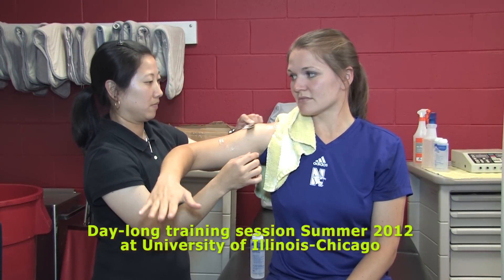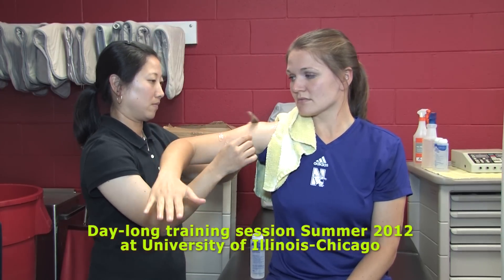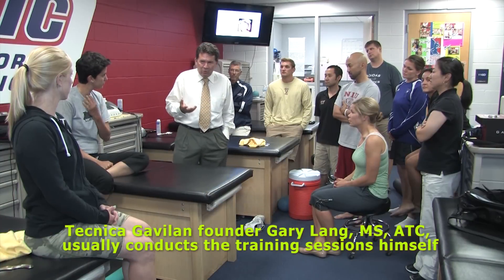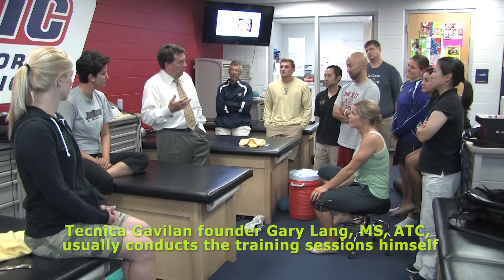She is performing a sweeping technique as Laura is going through external rotation. They are working on the rotator cuff, exposing any sort of adhesions in the fascia. Finding the thing that reproduces the pain, the problem, the injury, and then applying the instrument makes so much difference.